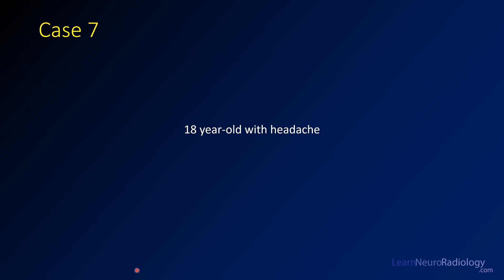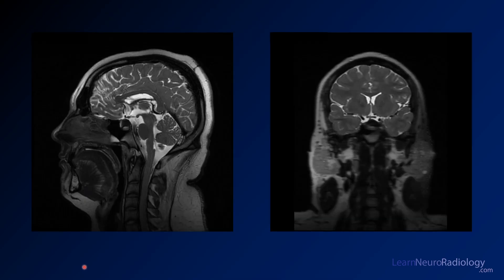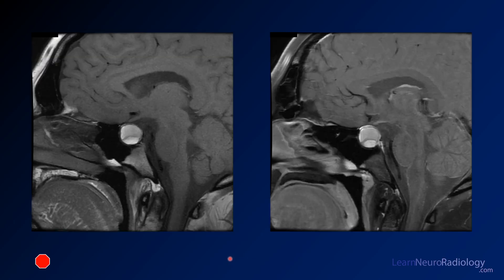For case 7, we have an 18-year-old with a headache. Here we have a sagittal reconstruction of CT through the head. If the abnormality doesn't jump out to you, don't worry too much — we're going to have some additional images. Here are images from an MR: thin slice T2 images reconstructed both sagittally and coronally, as well as pre- and post-contrast images.